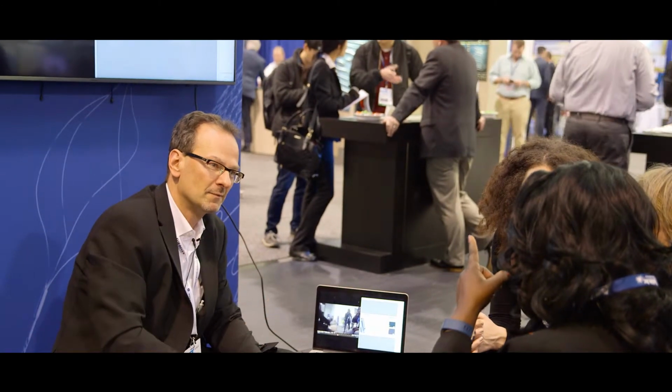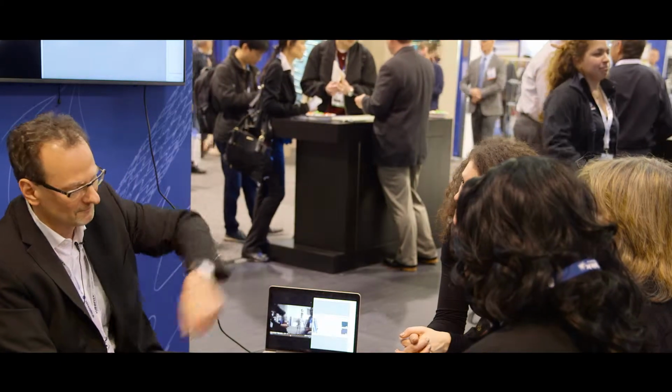What is this one targeted for? So people who start testing it, they couldn't break it so far. Oh, so they just quit halfway? Because at 400 million, that's what the FDA requires, and running it longer takes more time and costs a lot of money. Fatigue testing is pretty expensive. You typically try to reach the 400 million cycles, and you say, okay, great, cross out, done.